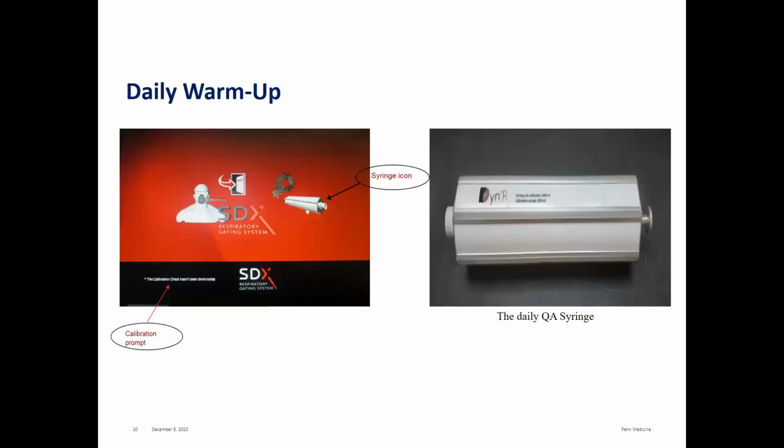So daily warm up. When you open the SDX system, the home page will tell you if the calibration has not been done. And it's right here, usually. To perform the daily QA, you have to click on the syringe icon shown right here.